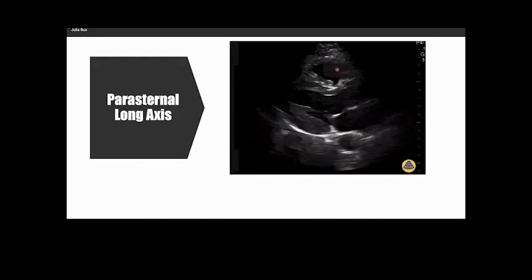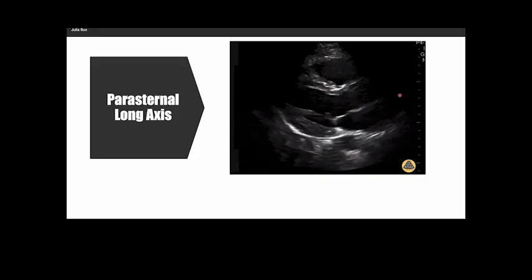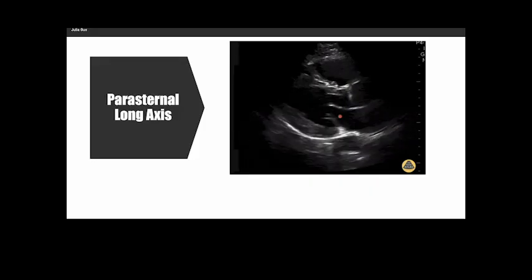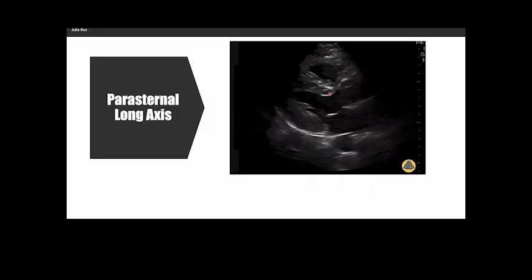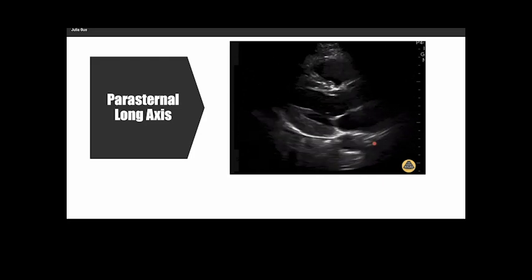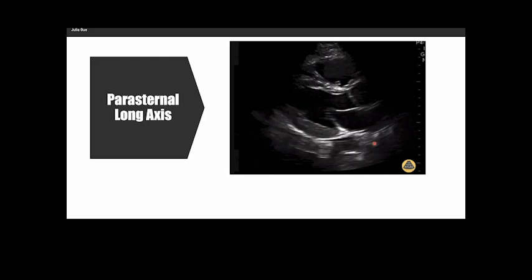And then this is the right ventricle, again, right here. And notice on this view, the mitral valve is opening and closing. It's almost tapping the septum right here, right? This is an example of a heart that's squeezing decently well, okay?